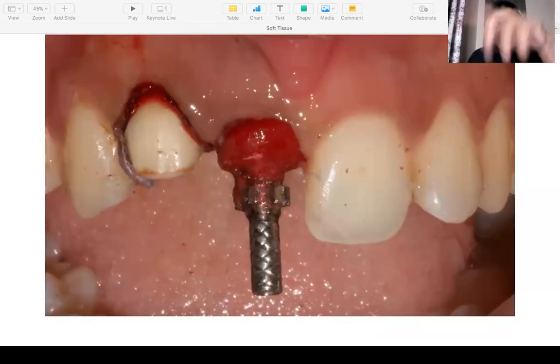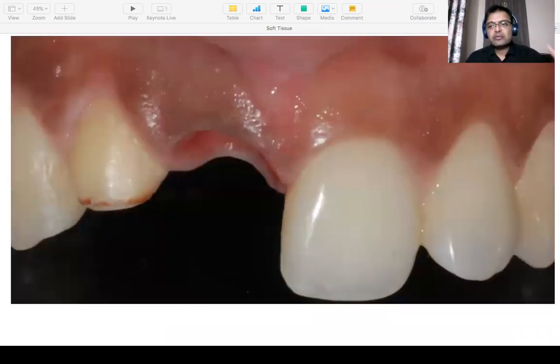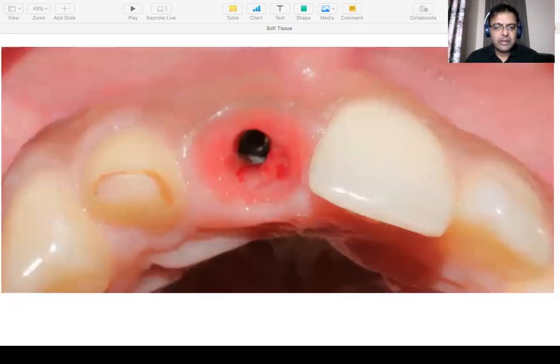So the lab gets exactly the same amount of form, the kind of emergence that you generated in the temporary. The lab gets the same thing on the model. So now they can customize the abutment so that you can have the ideal emergence. The emergence that you generated in the temporary is the same emergence that your lab is going to give you. Okay, so that's a custom-made abutment.